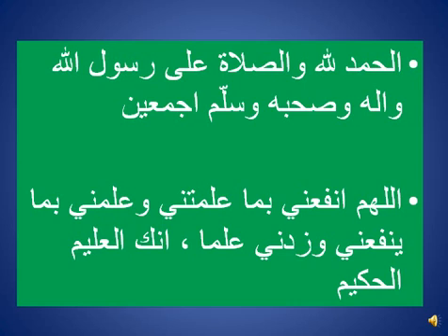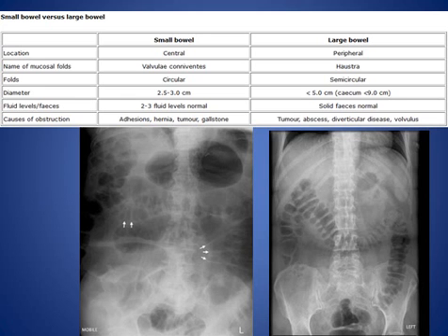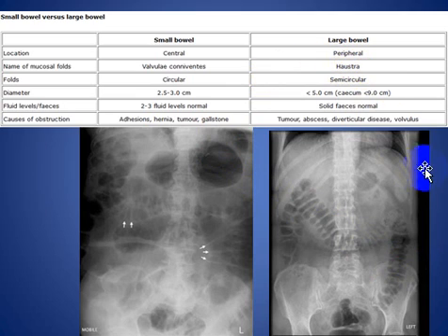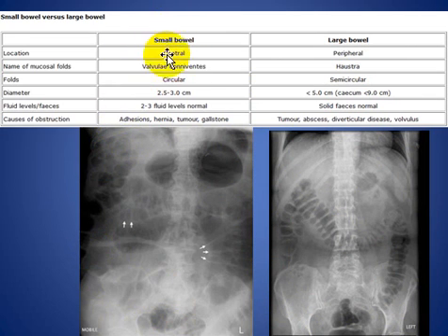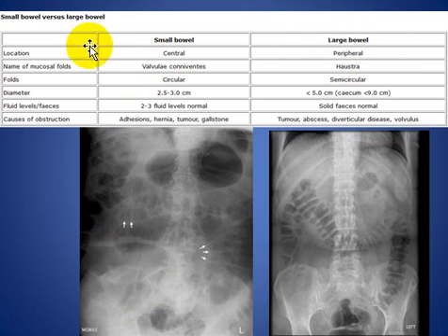My topic today is about how to differentiate small and large bowel on a plain film. Here we see a plain film of the abdomen, another plain film of the abdomen. How do we differentiate small bowel from the large bowel?